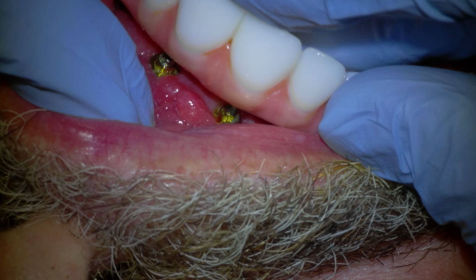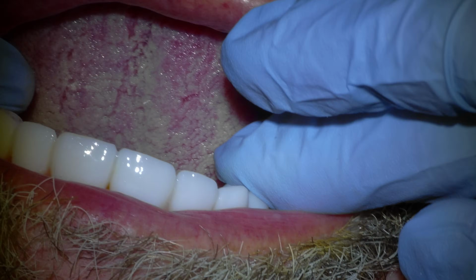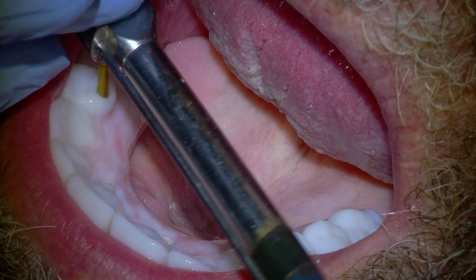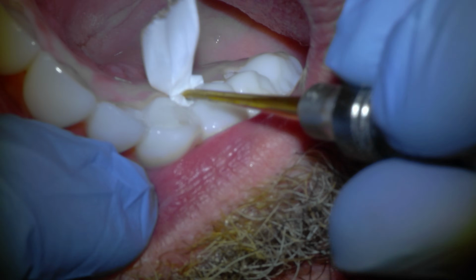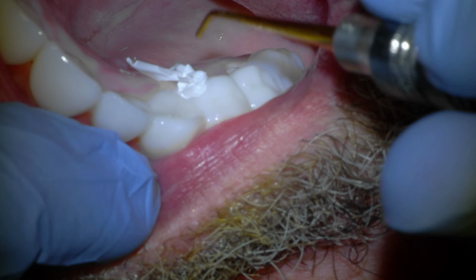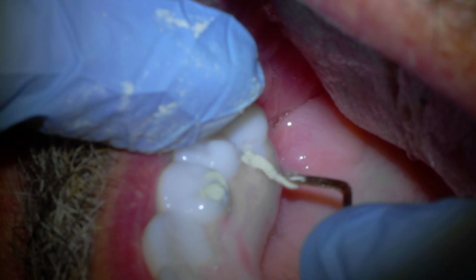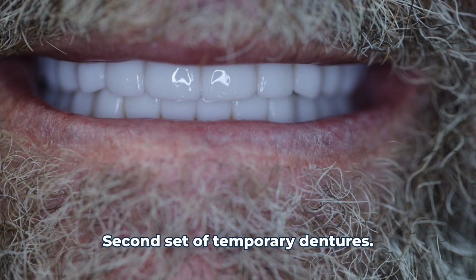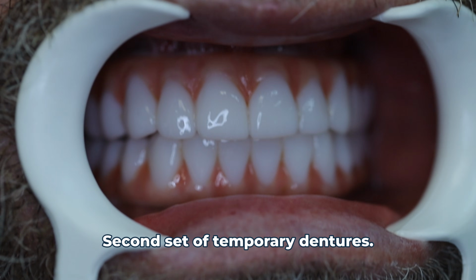It takes a while to screw them into place, but we make it look quick here because this is the boring part to me. Now, once again, over each of these screws, we put the Teflon in, and then we seal off the screw channels with some temporary material that is easy to remove. The fit of these new temporary or provisional dentures is perfect right off the bat, and we check the bite too, even though the patient tells me right off the bat that they love the way they feel.